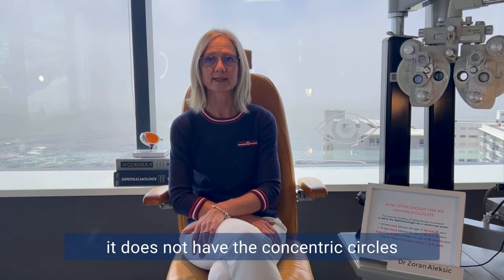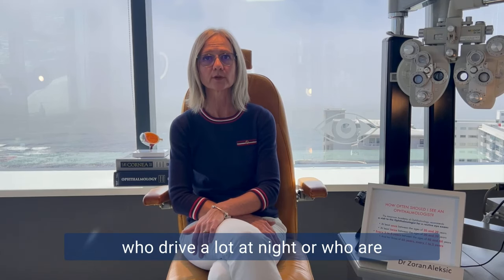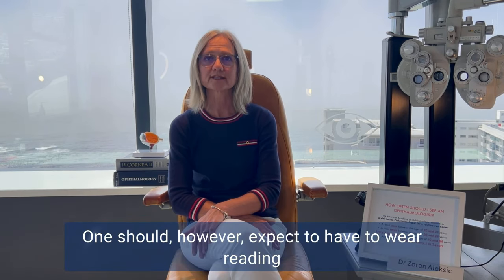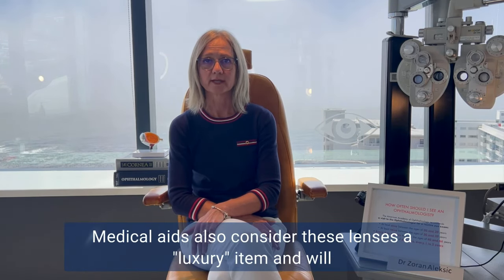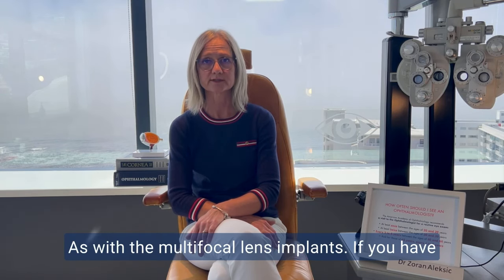The advantage of this lens is that it does not have the concentric circles and therefore has significantly fewer halos. This would therefore be a good option for people who drive a lot at night or who are worried about how the halos will affect them. It would also be a good option for people who are used to monovision with contact lenses. One should, however, expect to have to wear reading glasses at least sometimes, if not all the time. Medical aids also consider these lenses a luxury item and will also not cover the cost of the lenses in full, as with the multifocal lens implants.